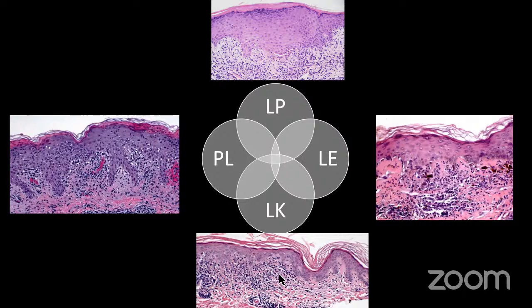And then lichenoid keratosis really can have a combination of findings. This is a classic presentation where you have a part of a lentigo at the edge and then a lichenoid tissue reaction that disrupts the basal layer. So lichenoid keratosis can present in a lot of different ways under the microscope, but it has a clinical presentation. And it's not really a keratosis, it's just a host response to the solar lentigo.